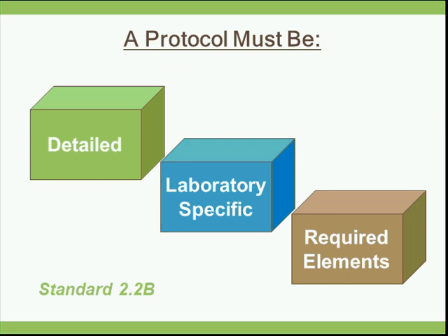To be in compliance with the standards, protocols must be detailed, laboratory-specific, and accurately describe the details of all procedures, and contain all required elements. When writing your lab protocols, keep this in mind. Your protocols should be so detailed and specific that any technologist could walk into your facility and perform a study exactly the same way you do.